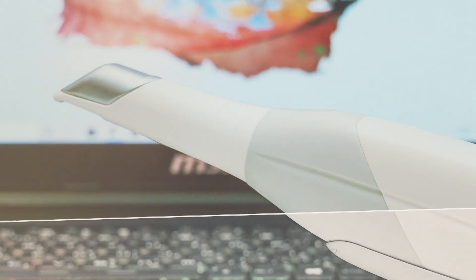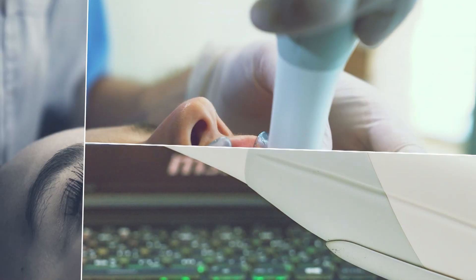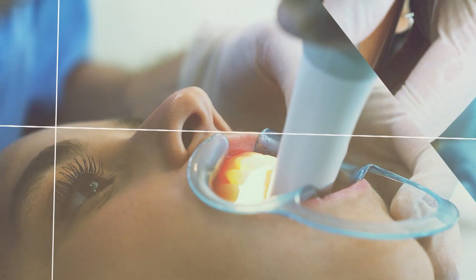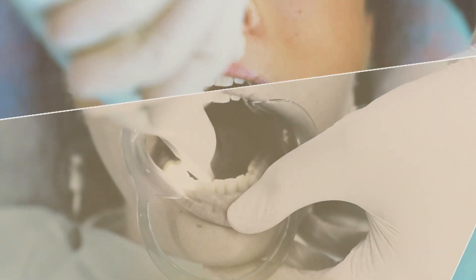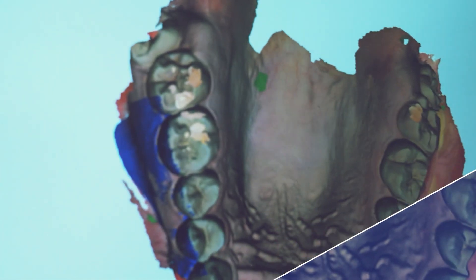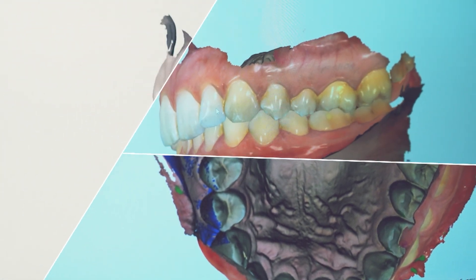Intraoral scans provide an alternative to conventional PVS impressions, where the patient's teeth are scanned and the digital model is used for the creation of the treatment setup and the fabrication of aligners. Scans have proven to be as accurate as conventional impressions and are more comfortable and easier to process.